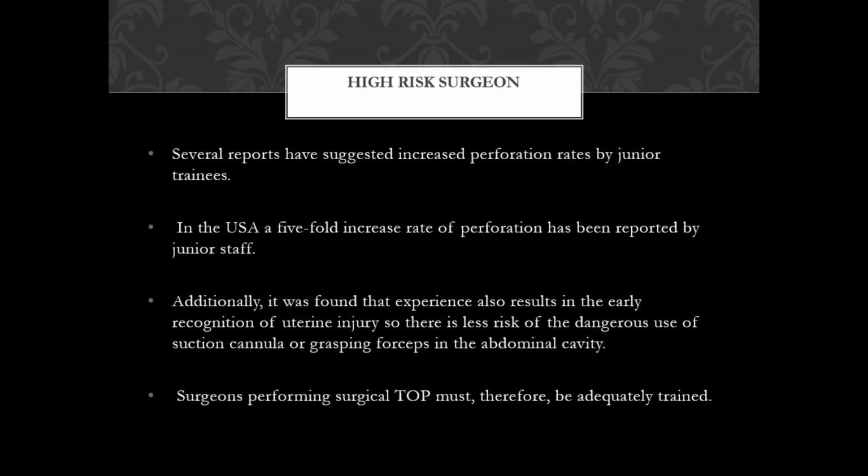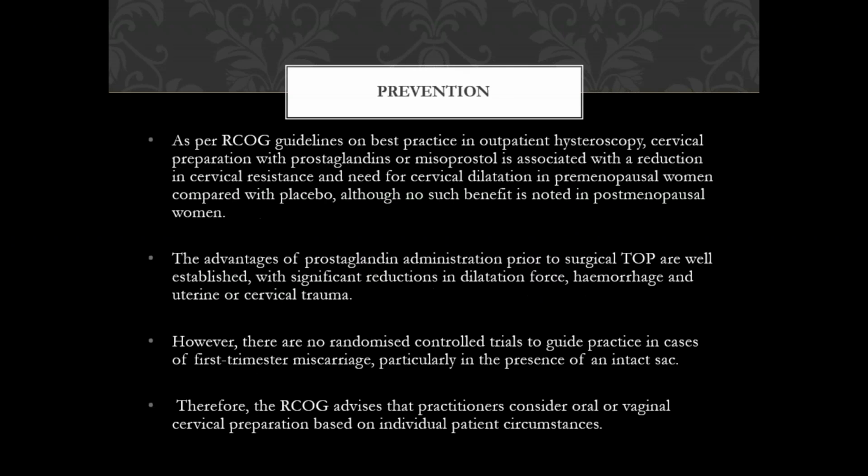This is the slide talking about prevention. How can we prevent injuries during hysteroscopy? RCOG recommends training programs, workshops, simulation sessions, and continuous upgrading by professionals in hysteroscopy use, and prostaglandin administration prior to surgical termination of pregnancy, to ripen the cervix, decreasing the risk of cervical and uterine injuries. All of these could be helpful.